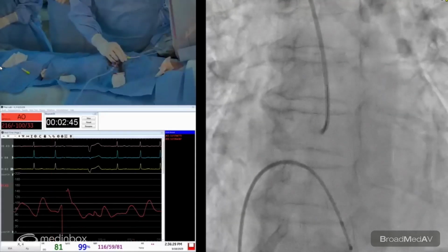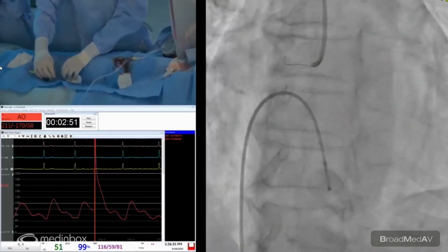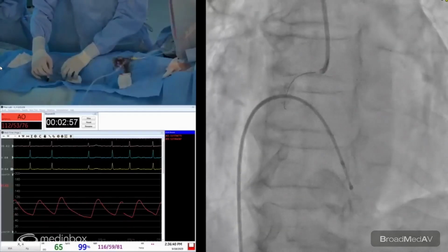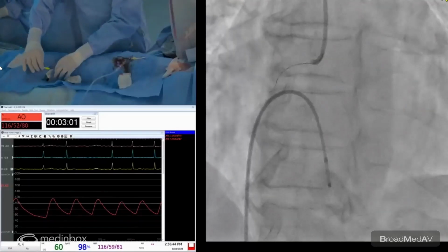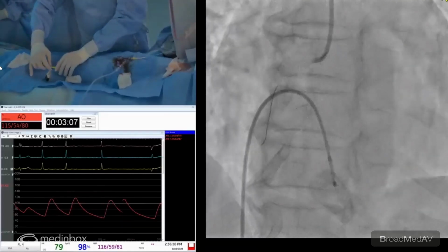Center, please. So I like when I do rotational, any type of atherectomy, I prefer to go with either a workhorse or a CTO wire off the bat. I don't know about you, Guillaume, but for me, it's easier that way. And then I switch. So that way I don't need to worry about manipulating a long wire.